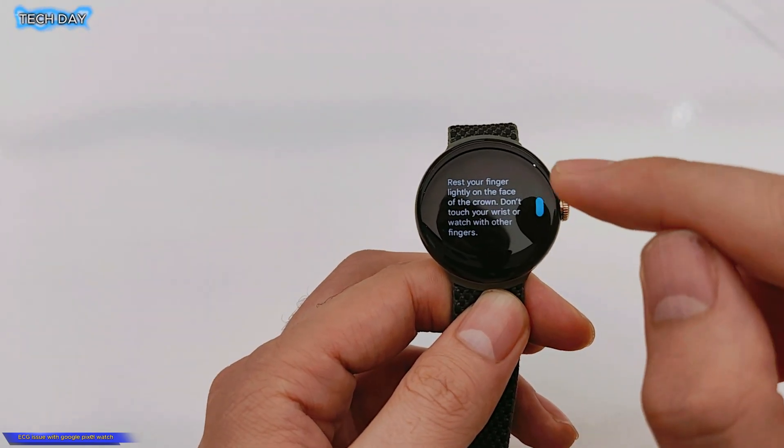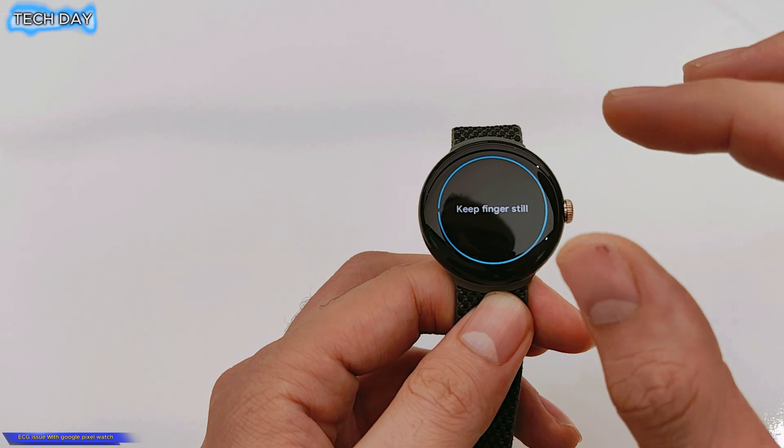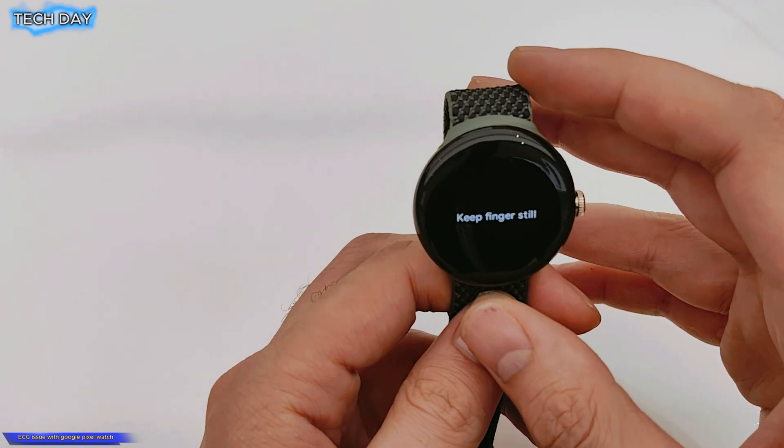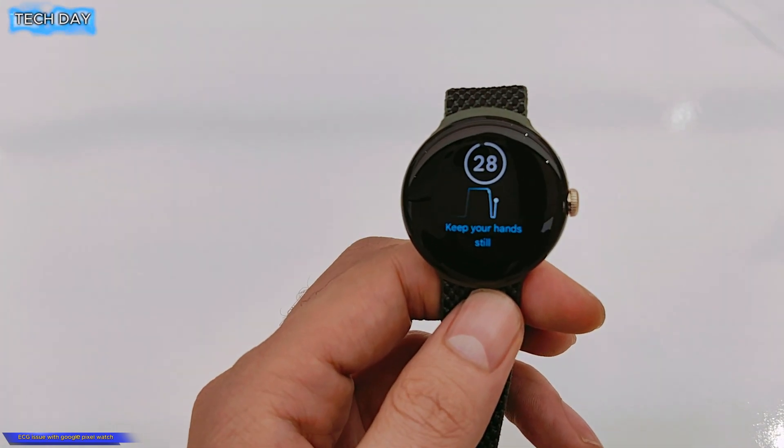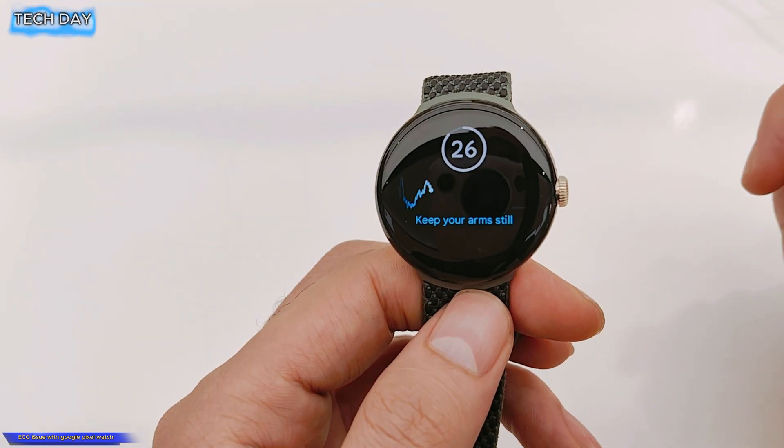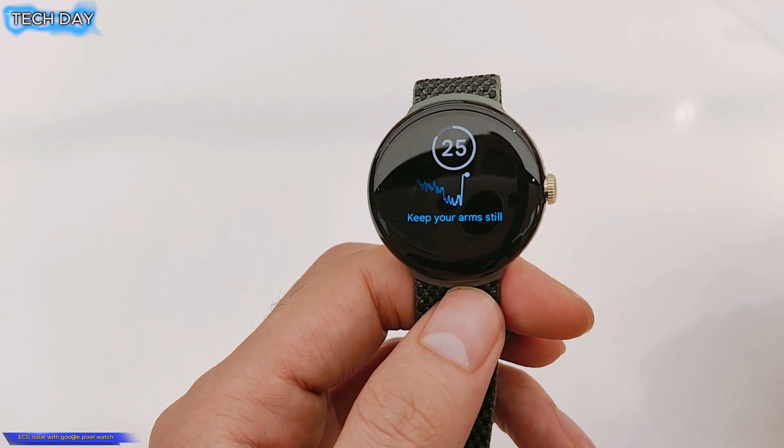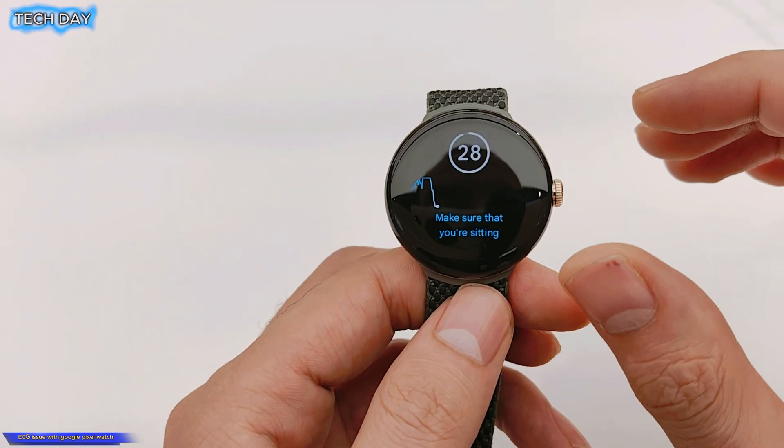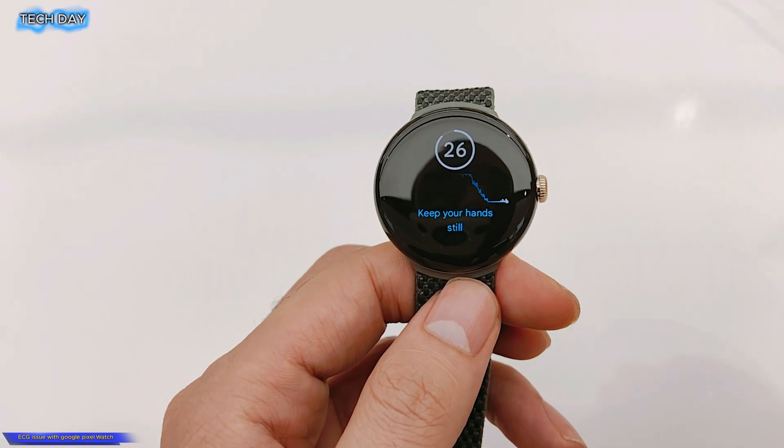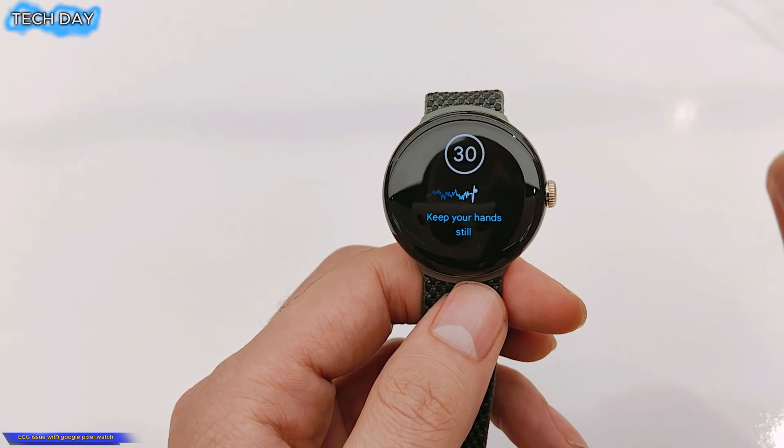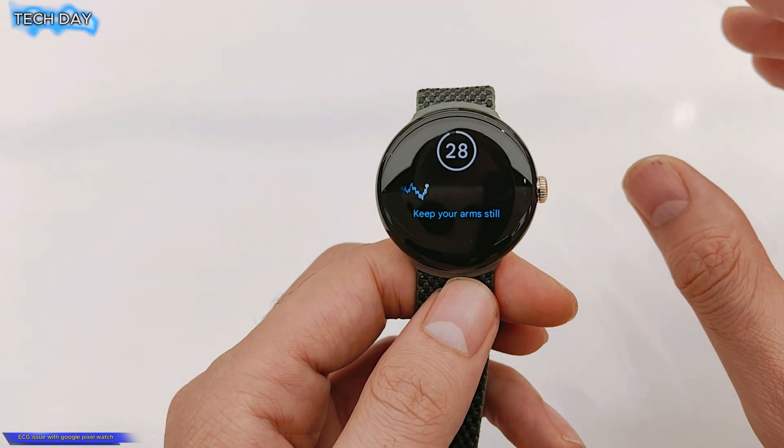There is another issue for the people who cannot use the ECG since it's not available or it's not exist in their region, because the ECG on the Google Pixel watch is available only in some countries, not all the countries.